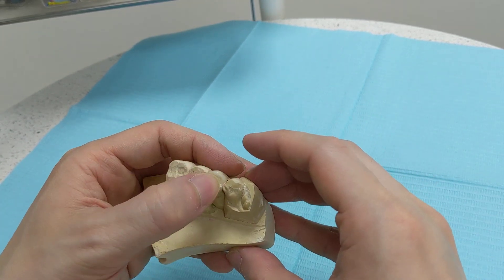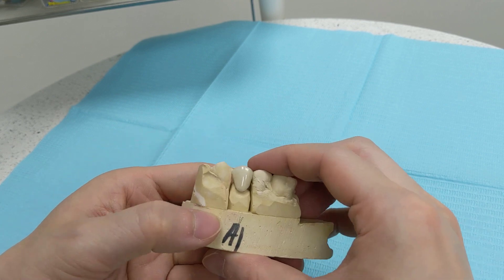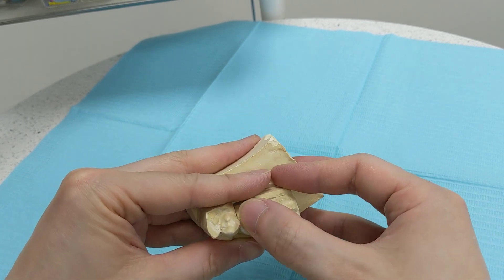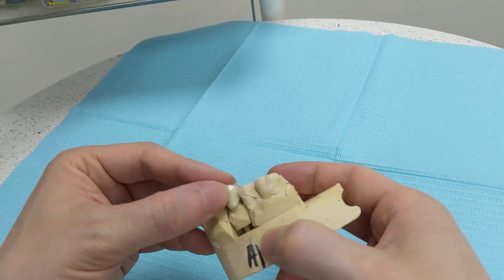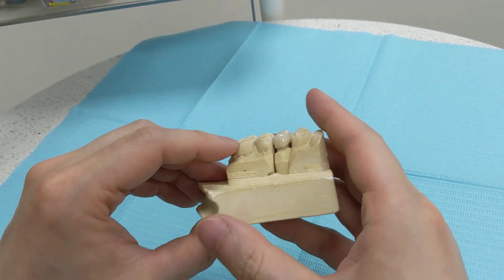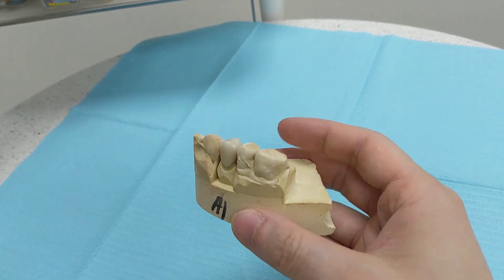I wouldn't recommend trying to do this at home because you don't have access to the tools we use. If you try to use a nail file, it'll probably take you a million years to shave it down to the shape you want. Just have your dentist do it for you.